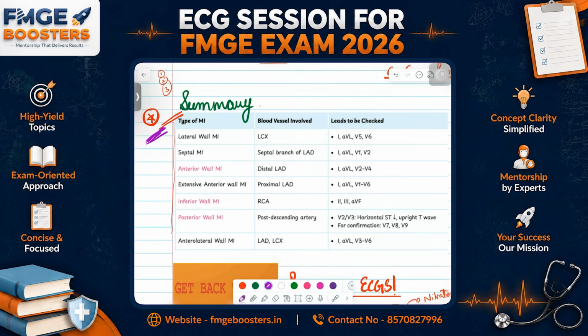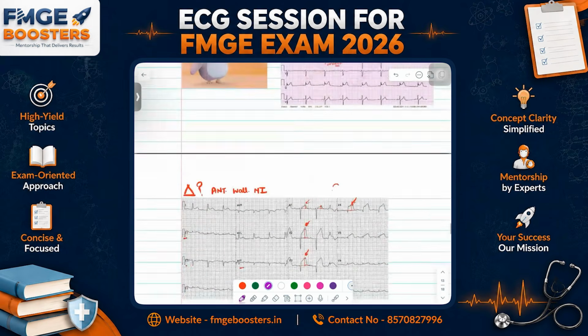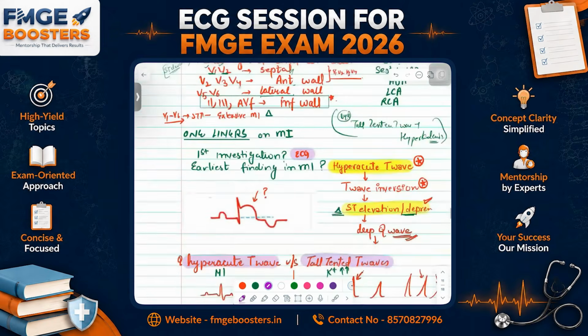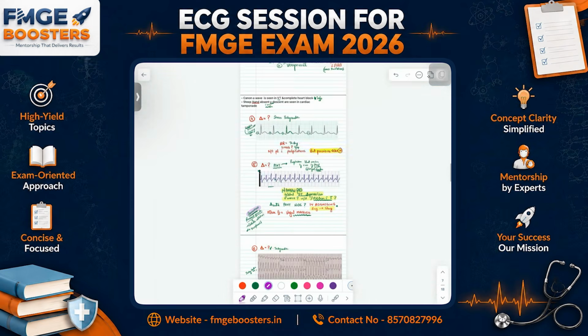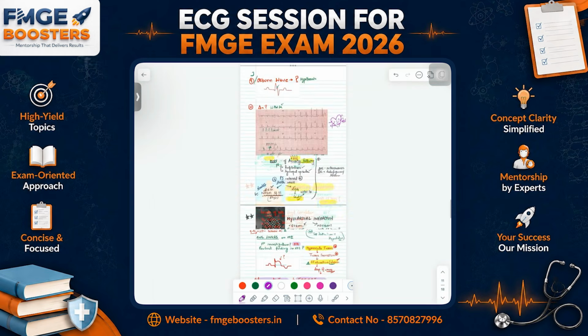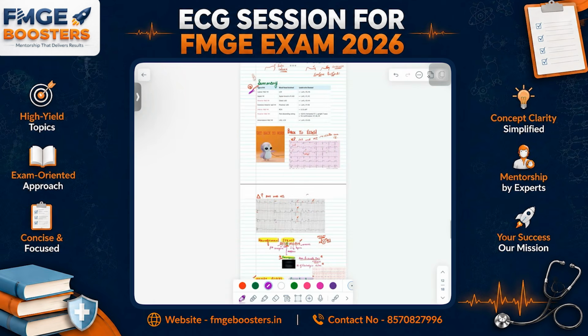लास्ट क्वेश्चन है मेरा, जो ये बाइजेमिनी और ट्राइजेमिनी वाला है, वो पढ़ने नहीं है ना. अरे नहीं नहीं, पढ़ो पढ़ो, पढ़ना सब है भाई. पर मैंने यहाँ पे हाई लिंक कवर किया कि आपको एटलीस्ट डायग्नोस तो बनाना है. बिकॉज बाइजेमिनी ट्राइजेमिनी अगर ऑप्शंस में आएगा तो बाकी दो ऑप्शंस तो इन ECGs में से आएंगे ना. यू माइट बी नोइंग कि ये बाकी सारी ECGs कैसी दिखती हैं. इवन इफ यू नो अदर ECGs, यू डोंट नीड टू नो ऑल द 4 ऑप्शन्स. इफ यू आर नोइंग 3 ऑप्शंस, इट मींस यू आर एबल टू रूल आउट दैट, है ना.